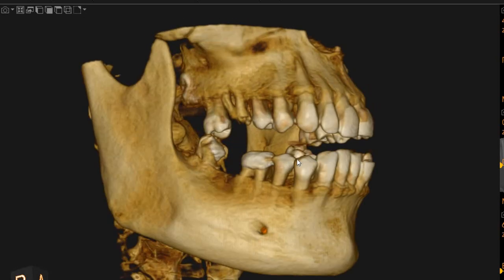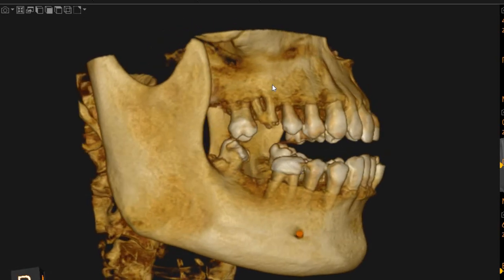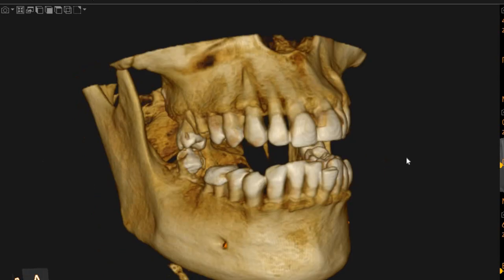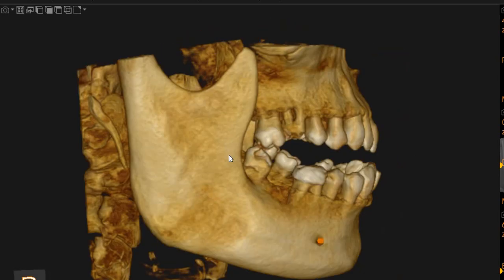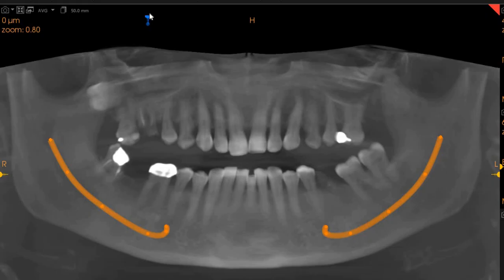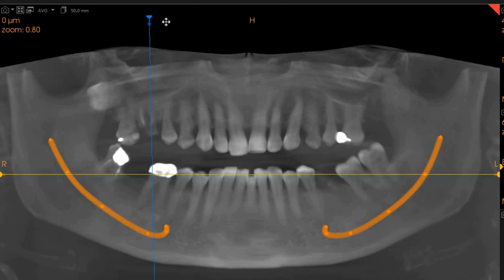This is the CBCT of the patient that you had requested. The area of interest is the upper right 5 and the lower left 6, but we'll just take you through the area. Now this is the panoramic view.